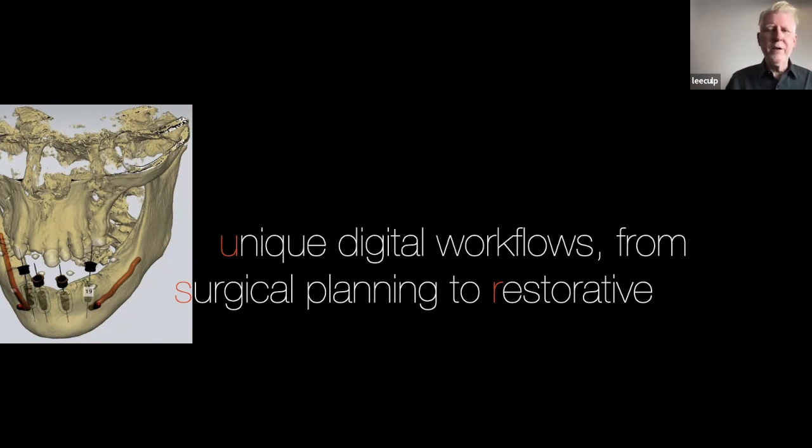Some of the things that make it easier, some of the things we've tried and done, little fiduciary markers. If you've got a big expanse of tissue and there's not a lot of diverse anatomy on the ridges, then you need to put something, fiduciary markers, little dots of composite, because those are easy to take off. But when your tissue gets really, really slick and there's not a lot of shape to it to be able to tie one scan to the other, that's when you're going to have a problem. But we have done many dentures on intraoral scans.